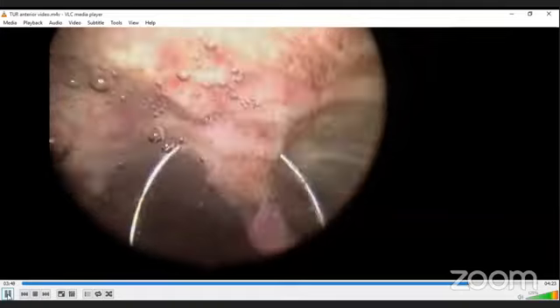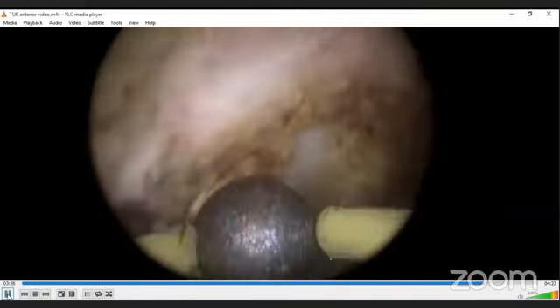As we come to the end, finally, we need a good hemostasis. That's it actually. So as the video goes on, any questions or any discussion, we can go on.